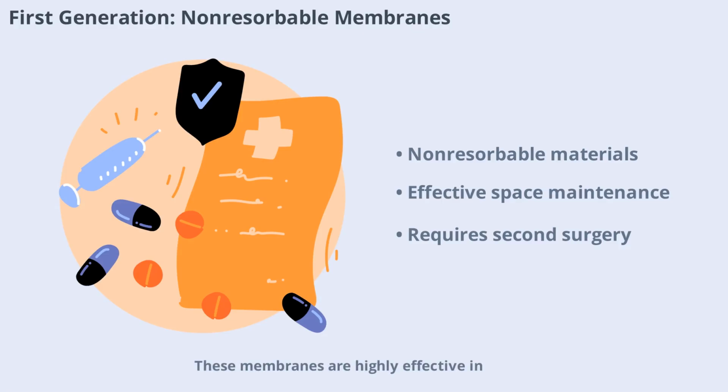These membranes are highly effective in maintaining space and excluding unwanted cell types, but their need for removal can increase patient discomfort and surgical risk. Despite these drawbacks, non-resorbable membranes remain a reliable option in certain clinical scenarios.